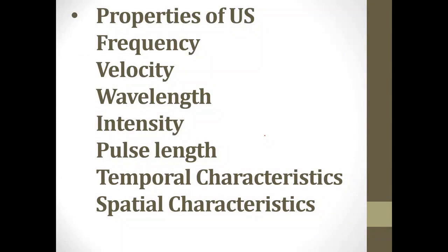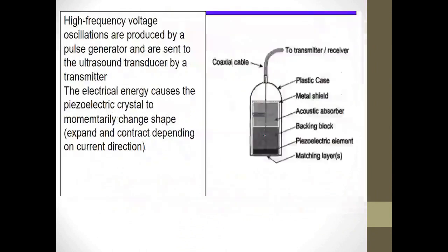Now, the ultrasound pulses emitted from the crystal do not appear in one direction. They are emitted in all directions. For example, when you look at the probe, you see that there are pulses appearing in various directions, and there are pulses that return. You find that there are pulses that penetrate and continue to penetrate repeatedly.